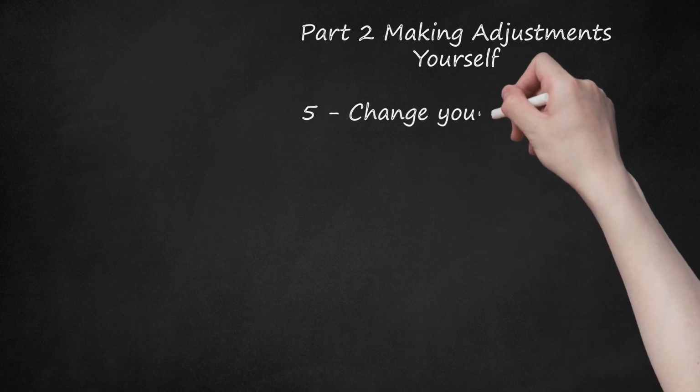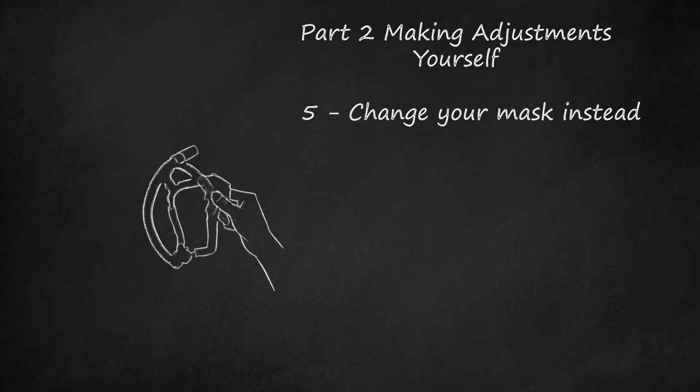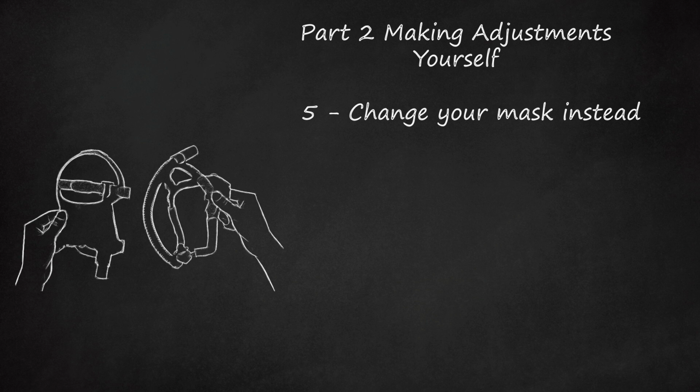5. Change your mask instead. Sometimes the problem isn't actually with your air pressure, it has more to do with the type of mask you're wearing. The design of some partial and full face breathing masks doesn't allow the air to flow through them, especially through the nose piece, as well as others. In essence, some masks create more resistance than others do.